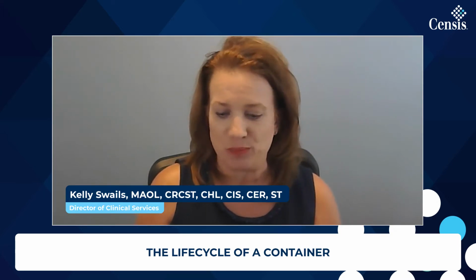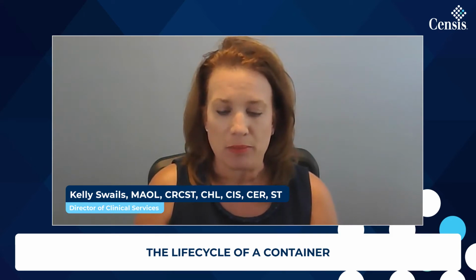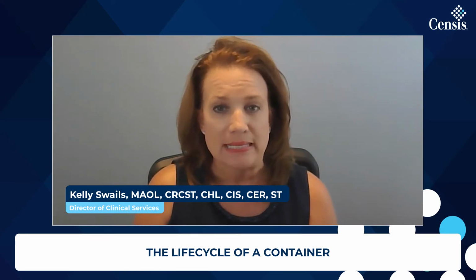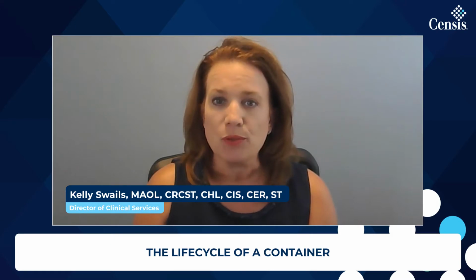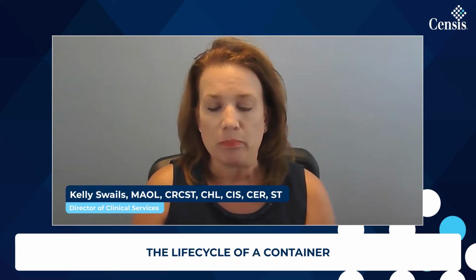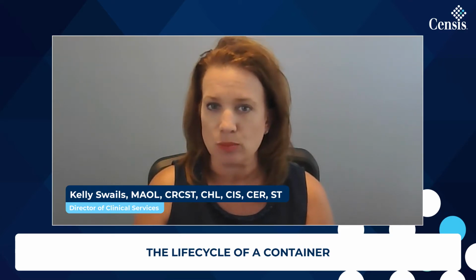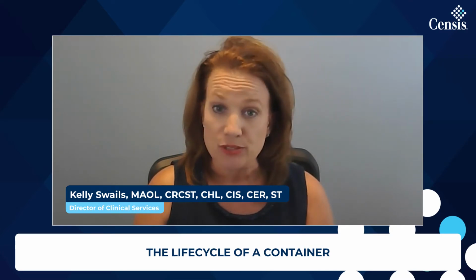Yeah, so you think of that life cycle of a container, it's never ending. And so we'll start with decontam. That's where they go in and they get cleaned. And that would probably be the number one area that I see where it's not documented. So the sets come through decontam, they go through a pre-clean, go through the washers. And if you have a tracking system, wonderful. You then have that capability to, with CensiTrac, scan to that decontam module. You've now documented in that container history that set was cleaned.